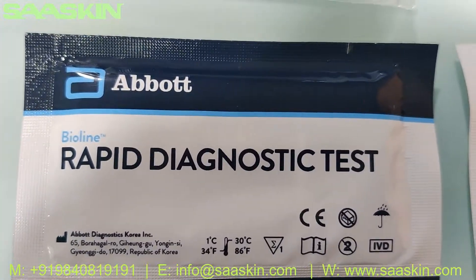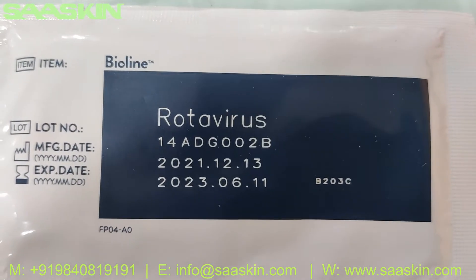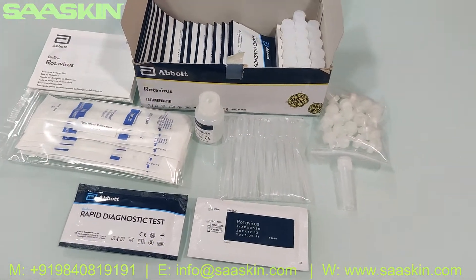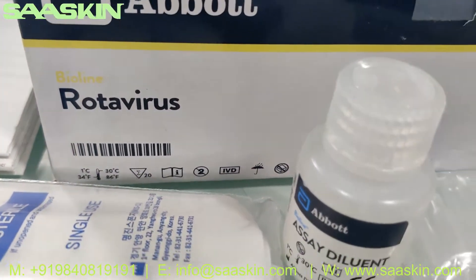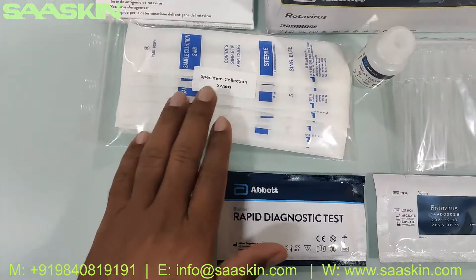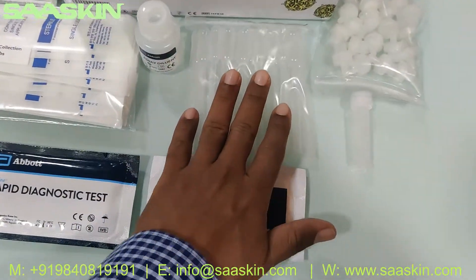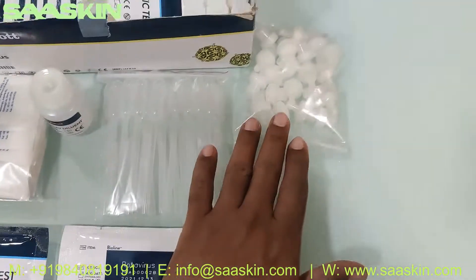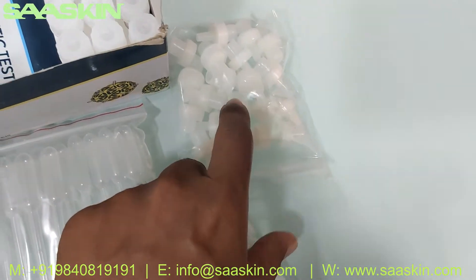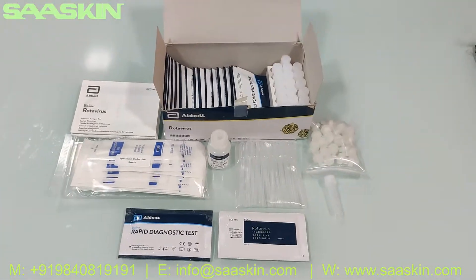This is the Abbott BioLine rotavirus diagnostic test kit. On the back side you can see the lot number, manufacturing date, and expiry date — 18 months on the standard. To summarize: this is the Abbott BioLine rotavirus 20-test kit pack, CE certified. Inside you get one IFU brochure, 20 specimen collection swabs, one 25 ml diluent buffer, 20 capillary tube fillers, 20 extraction buffer tubes, 20 nozzle caps, and 20 test cartridge devices.